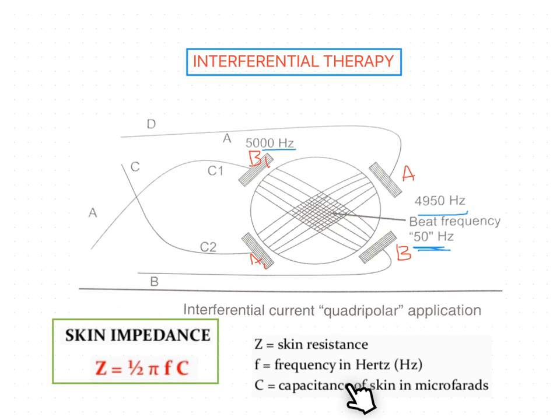Only the resistance and the frequency change, so these two are inversely proportional. If skin resistance is more, the frequency is very low. If we apply more frequency, then the skin resistance is going to reduce.